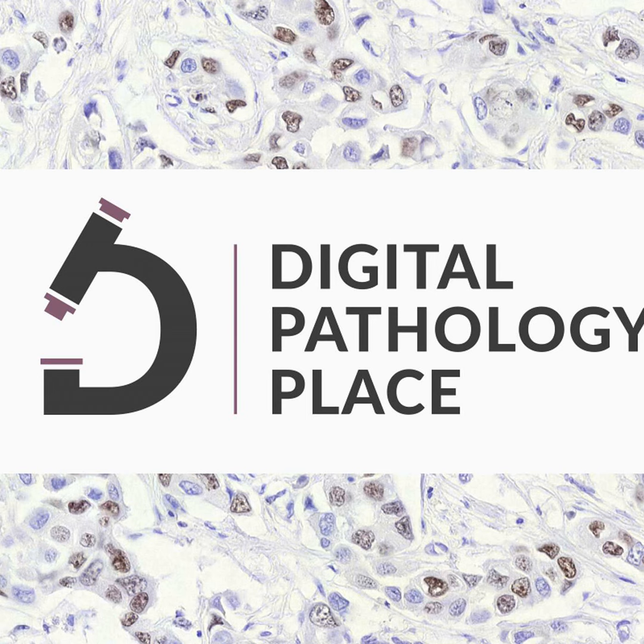The teaching is done by annotating. If you have some server in the basement of some company, how do you get easy access for the pathologist? So having a web-based system that runs in the cloud solves many practical problems of how to teach AI, and how to get pathologists easy access to AI teaching.